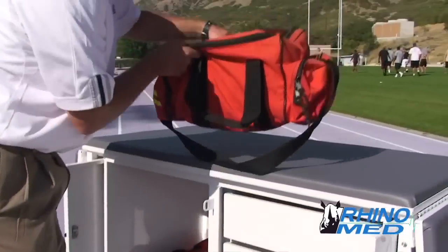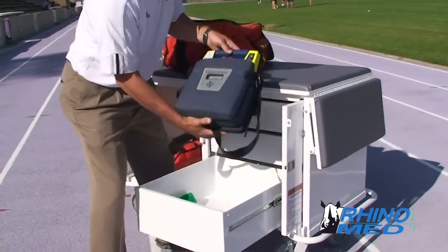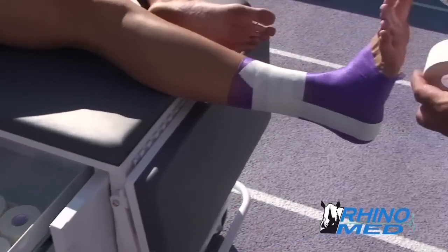The cart features a large storage compartment and three drawers for organizing and storing supplies. The drawers, which hold 100 pounds and securely lock in place, can be configured for the quickest access to needed materials.